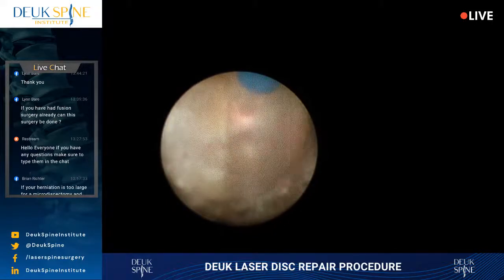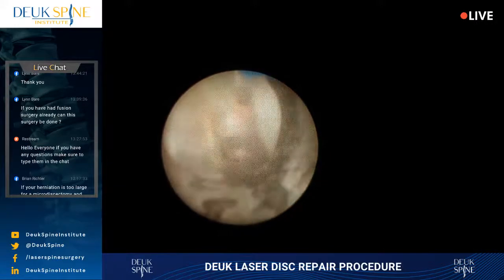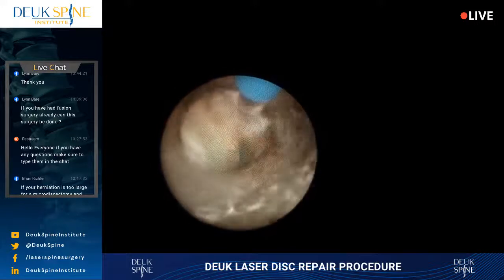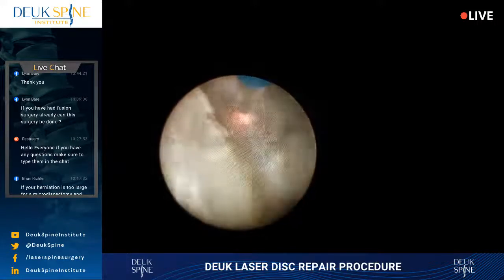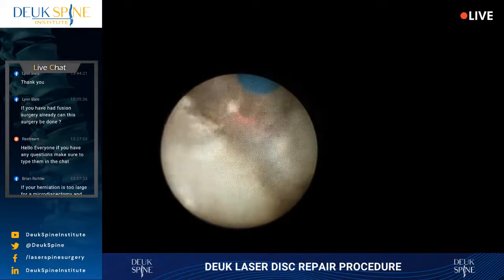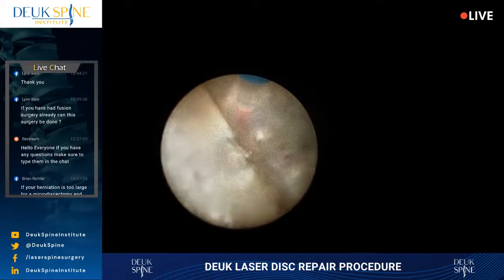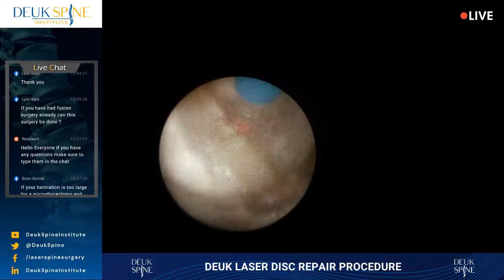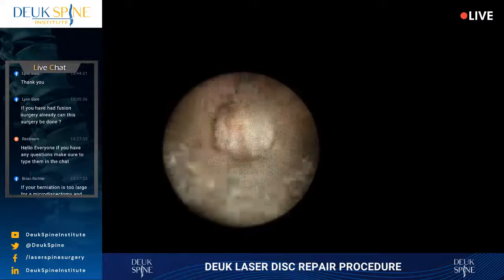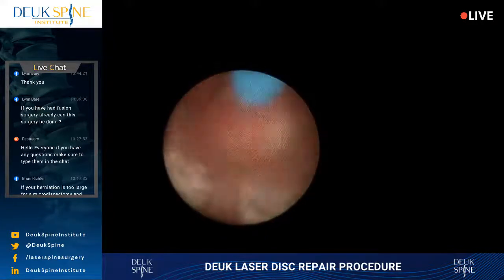The spinal cord is no longer compressed. We've removed everything that was pushing on it. There's a little bit left stuck to it, but it's not compressing it. So this is where you have to really use good judgment. I've decompressed the spinal cord here. There's a thin layer of scar tissue on top of the dura, and I feel like we've gotten everything we can get out safely. When I look over at her foramen on the right side, the foramen is decompressed. There's nothing in there. We've gotten all those herniations out. So we're done.